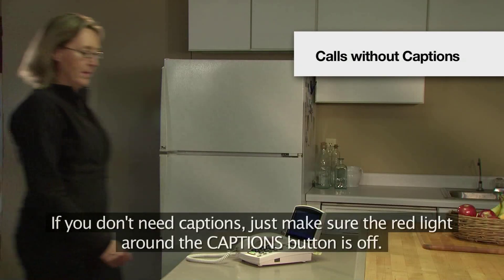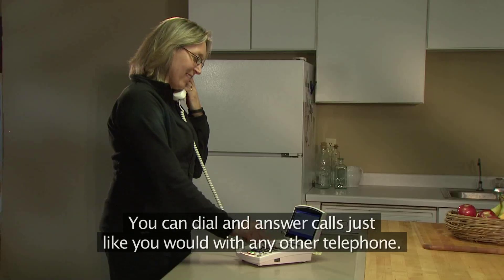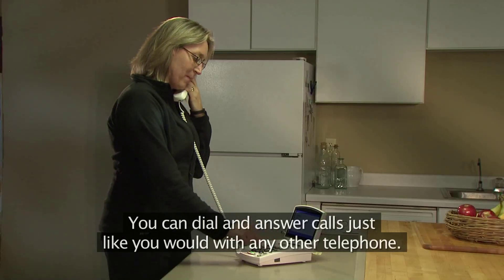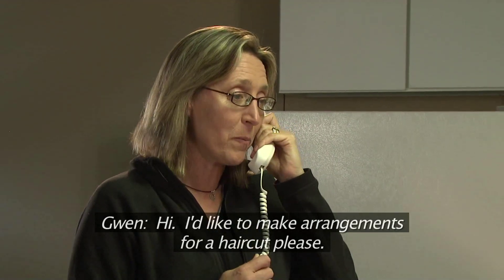If you don't need captions, just make sure the red light around the captions button is off. You can dial and answer calls just like you would with any other telephone. Hi, I'd like to make arrangements for a haircut, please.